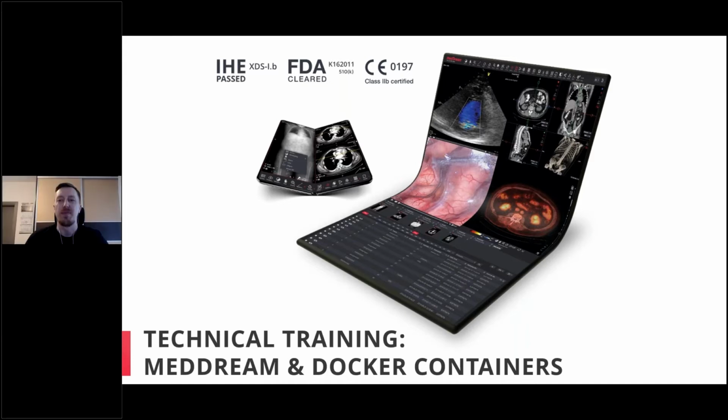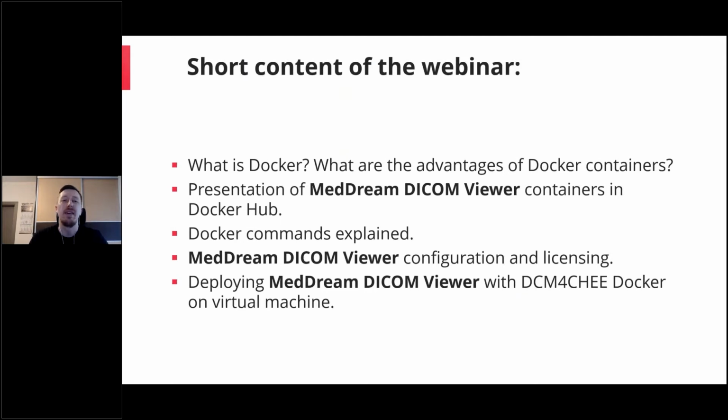So for today, we will discuss MedDream and the Docker containers. In this webinar, we will discuss what Dockers are and what the advantages of using Dockers for MedDream are. Also, we will present which MedDream products, MedDream Viewer Docker containers, we have on Docker Hub. Also, we will explain the most used Docker commands which you will need if you try to deploy MedDream yourself and test it. So we will discuss this during the webinar.